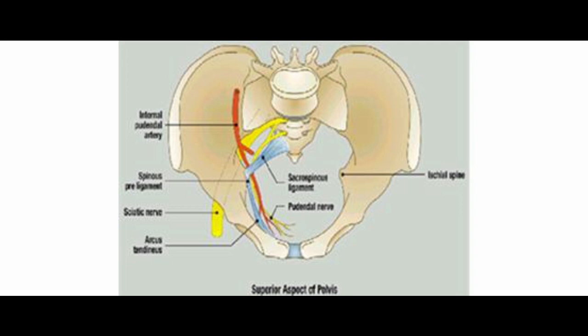Therefore, it is ideal to take the stitch 2 cm medial to the ischial spine and at least half a centimeter below the upper margin.